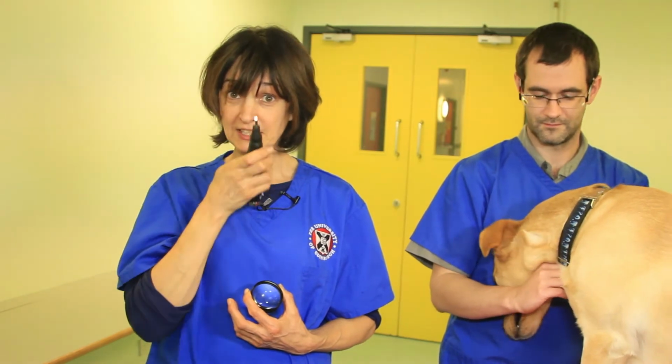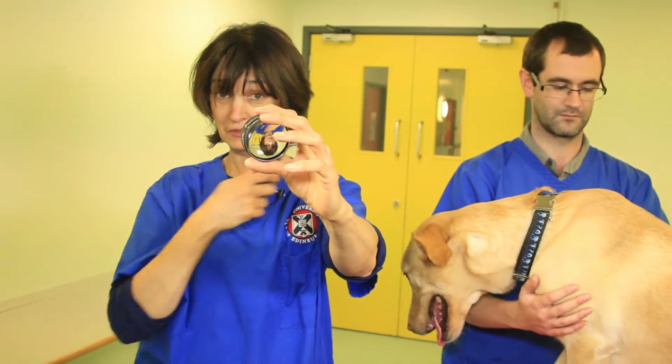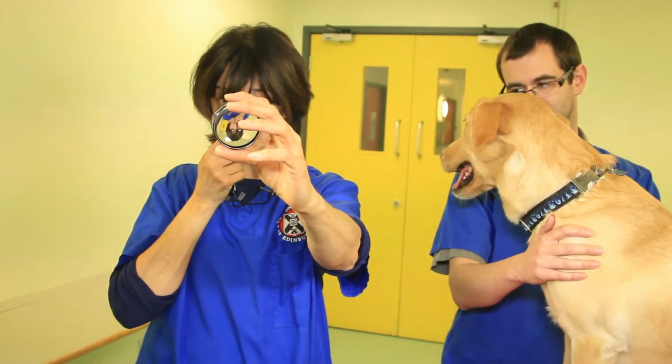You then want to make sure that your light source is parallel to your gaze. So you hold it at your temple or at your nose. Ideally you'd have it there between your eyes, but that looks ridiculous and gets in the way. So at your temple or at your nose, so you're looking directly down the beam of light. If you have your light coming in from an angle like this, it is going to be reflected on the lens to disappear over your shoulder. So you want to line it up with your position of gaze at your temple, at your nose.